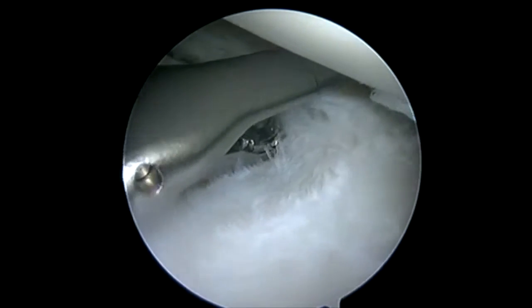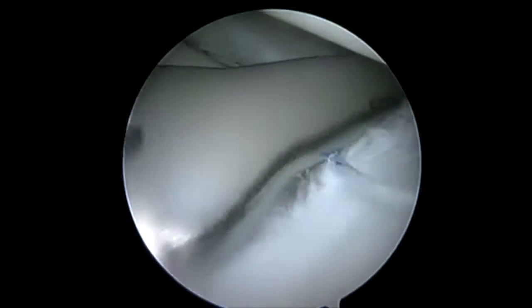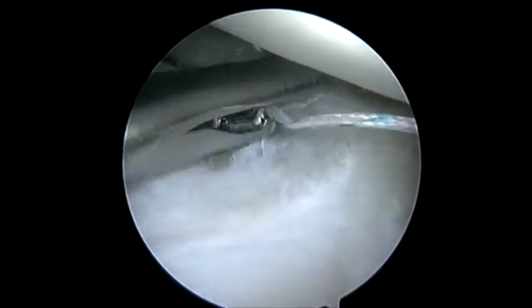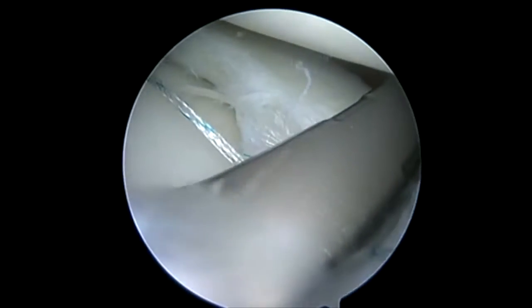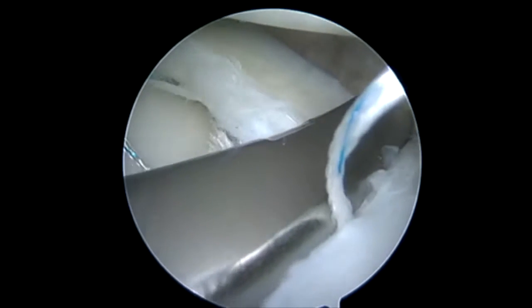These anterior horn tears are specifically in the lateral meniscus. I'll tunnel underneath the lateral meniscus from the lateral portal — medial, obviously. I just go through the medial portal, visualizing from lateral. I'll place the spinal needle underneath the inferior lamina and just shuttle a suture around the anterior horn.